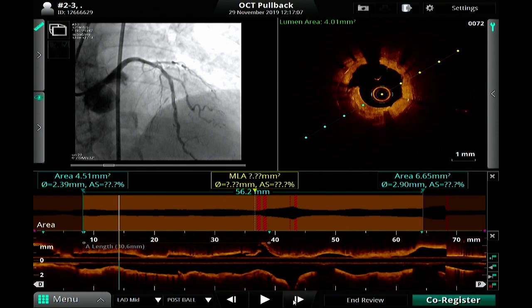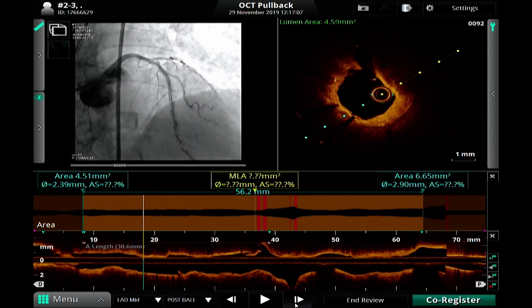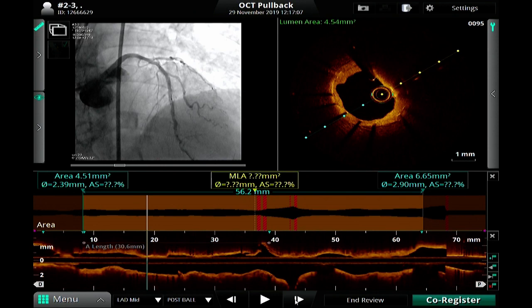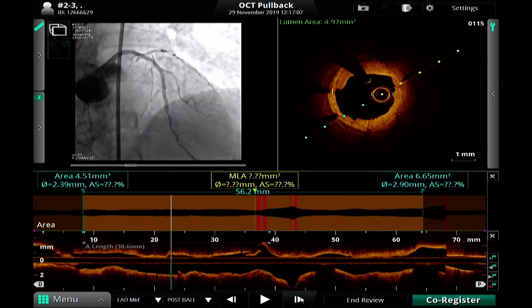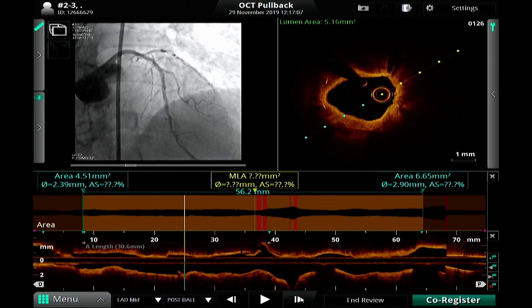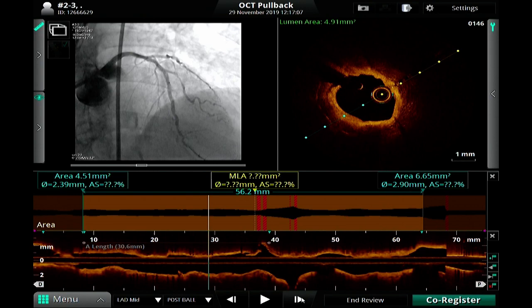You can see some cutting of the nodular calcification, especially at 9 o'clock. Next, move on. The lumen became bigger. Here, stop. There is some limitation of the lumen, especially because of the in-stent calcification, which was not dilated. Next, move on. There is some limitation of the lumen dilation because of the strong in-stent calcification. Here also you can see the limitation. But overall, the result is good.